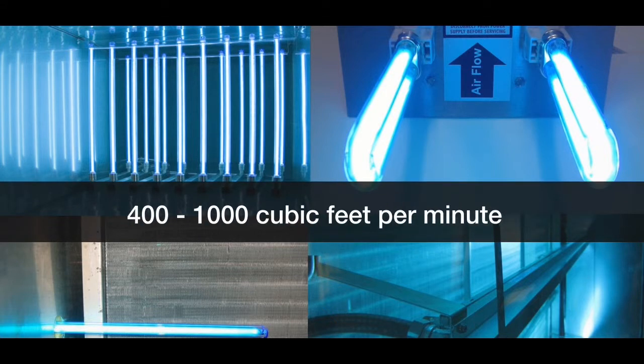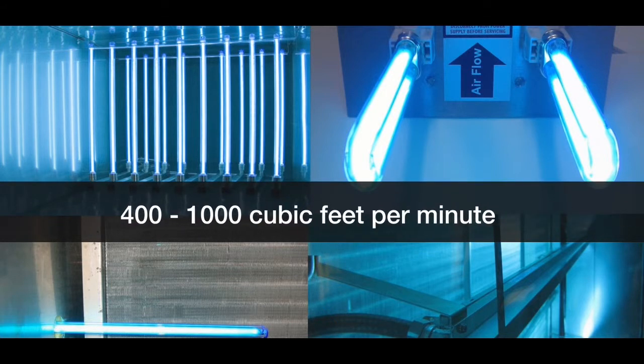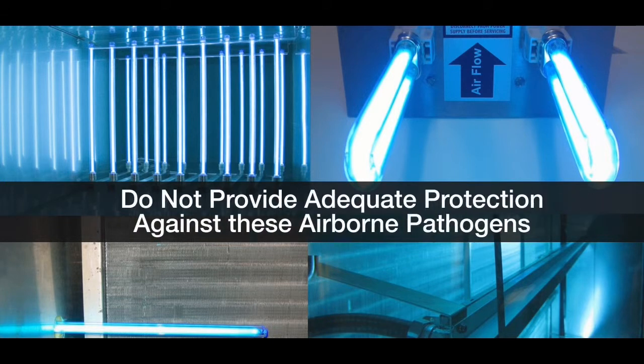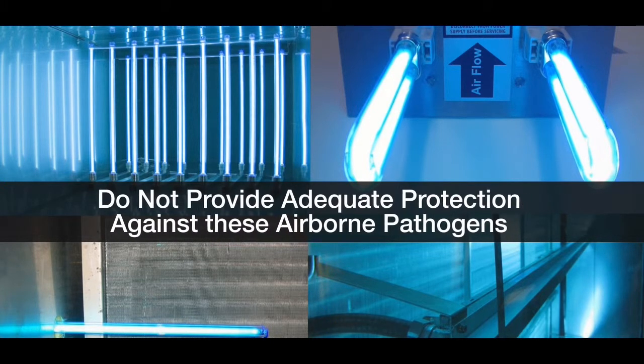The airflow rate in most HVAC systems is between 400 and 1000 cubic feet per minute. With this volume of airflow the UV lamps in a duct do not provide an adequate protection against these airborne pathogens.